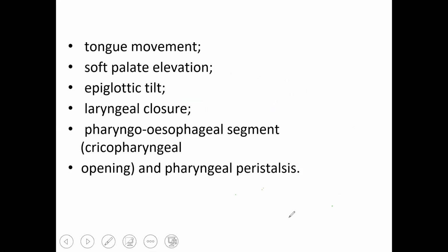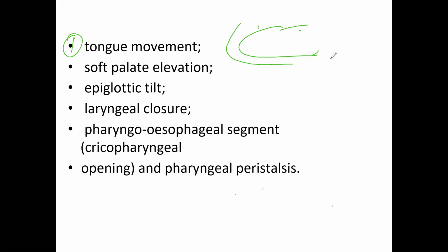Which will be helpful for number 1, tongue movement, and soft palate elevation. As you could see here, number 1 is tongue movement. You can see how the tongue is moving within the mouth, the oral cavity. Next is soft palate elevation.